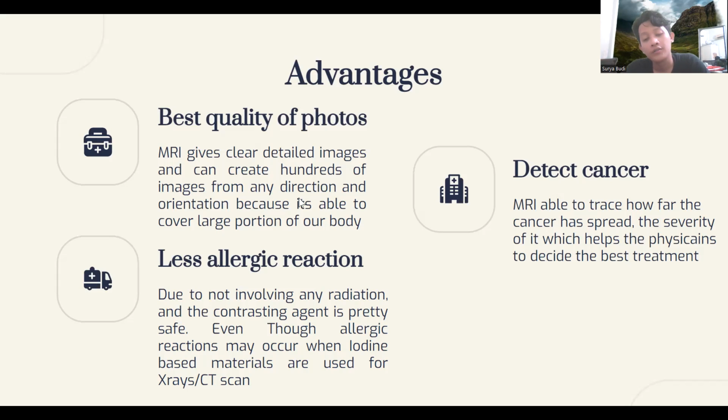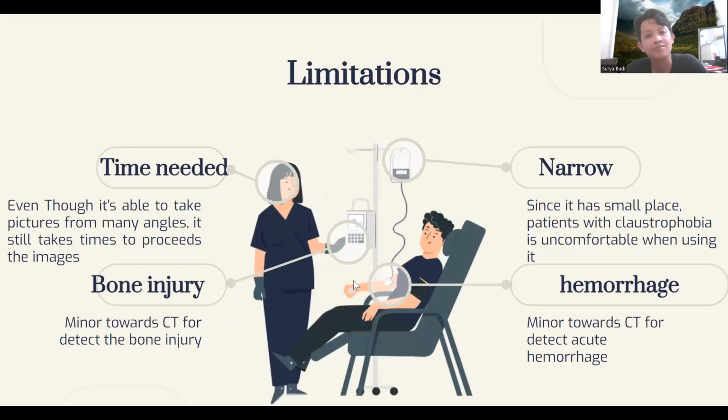And the last advantage is that MRI can detect cancer. They are able to trace how severe the cancer has spread and also how far it is in the patient's body. And it can help the doctor or the physician to decide on the best treatment method that they can give to the patient.